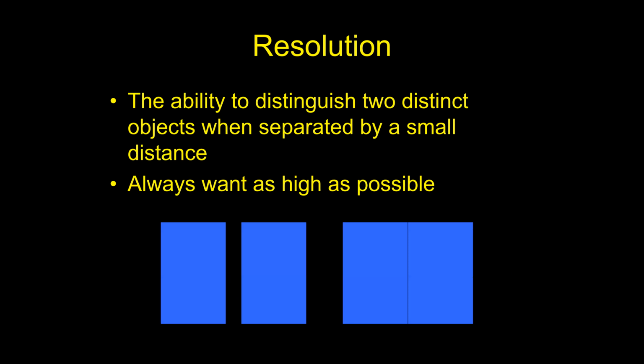Okay. So now we have to talk about resolution. When we talk about imaging, we talk about how crisp the picture looks. You can even use this analogy with a digital camera or your iPhone when you're taking a picture. Obviously, if you take a picture of somebody, you want their face and everything else to be nice and crisp, where you can really see it, and it's a nice, pretty picture. On the other hand, if everything's really blurry, that would be poor resolution, and no one likes to look at a picture that has poor resolution.